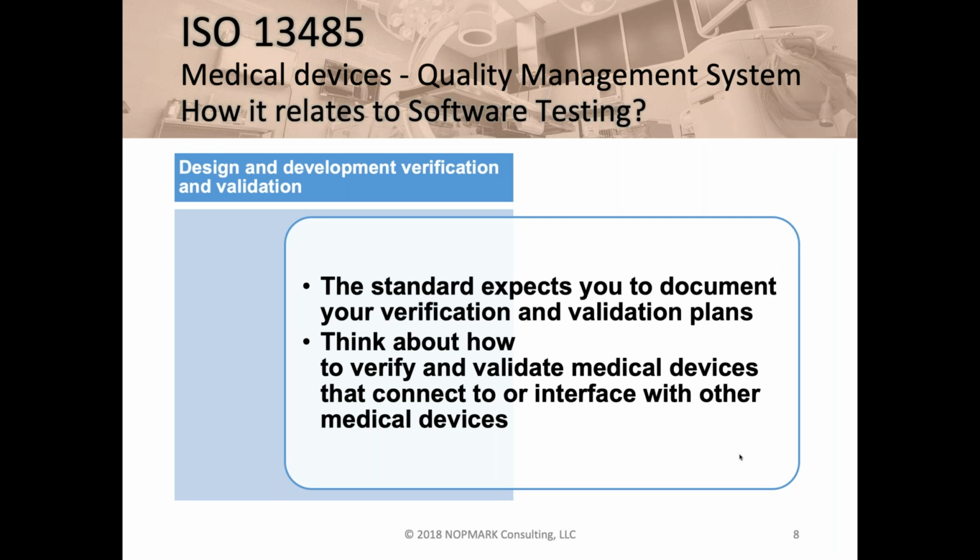And today, almost every medical device or medical software has some type of interface with the outside world, whether it's an electronic health record system, a different app that's processing the data, or a combination of devices on the same network. So almost everything today is connected to interface with other medical device software. So this standard asks that in your plans and in your activities, you are thinking about not just your software, but everything else that's connected to it, and your testing includes those scenarios as well.